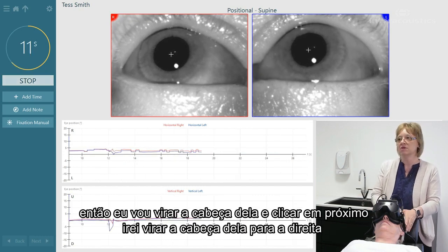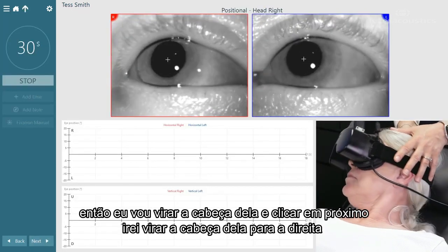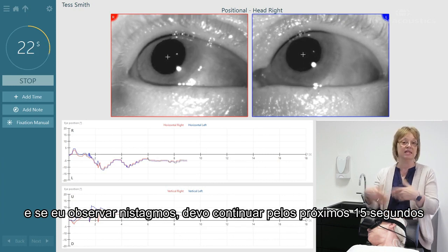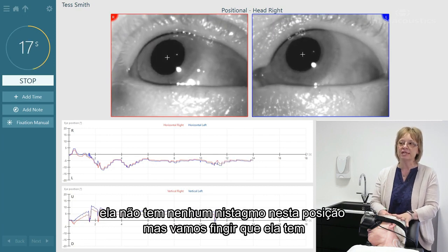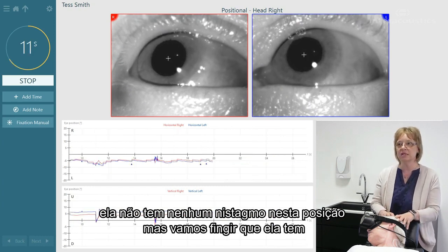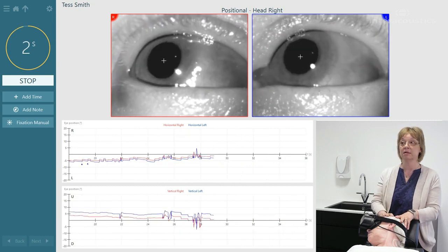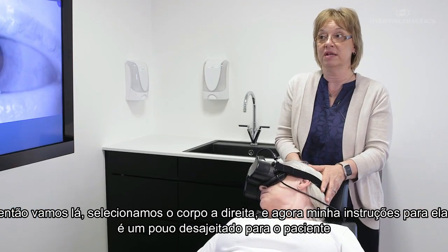Now I'm going to turn her head to the right. I'll hit next and turn her head to the right, then do the same thing — about 15 seconds, and if I don't see anything I'll stop the test. If I did see nystagmus I would continue on for another 15 seconds. She doesn't have any nystagmus in this position, but we're going to pretend as if she did. If she did have nystagmus, we would want to open up the body-to-the-right subtest, so we'll select that now.